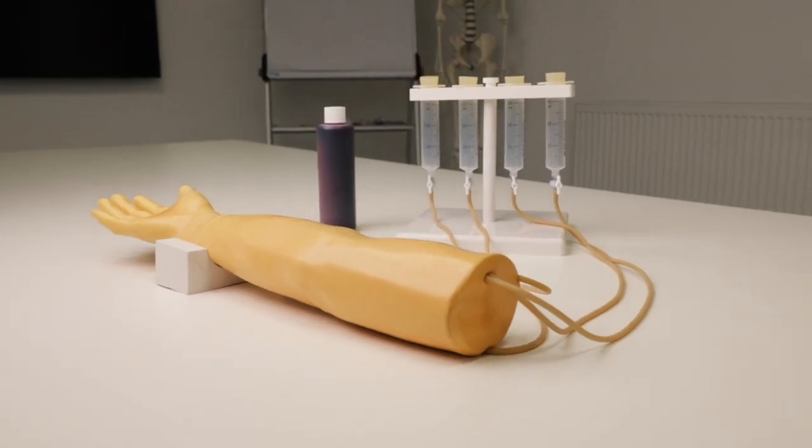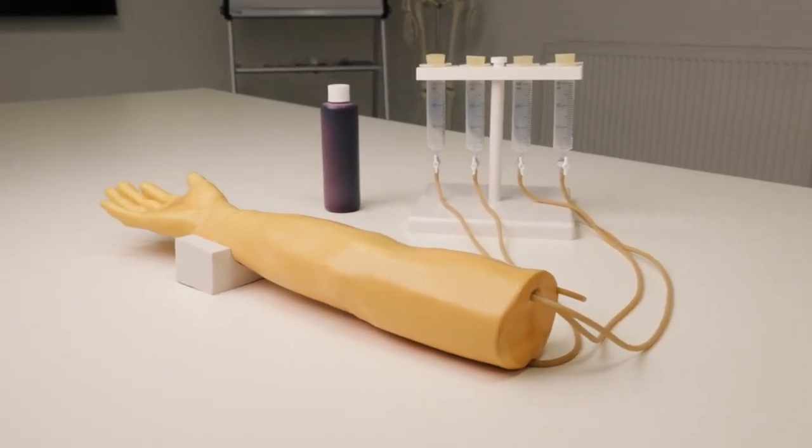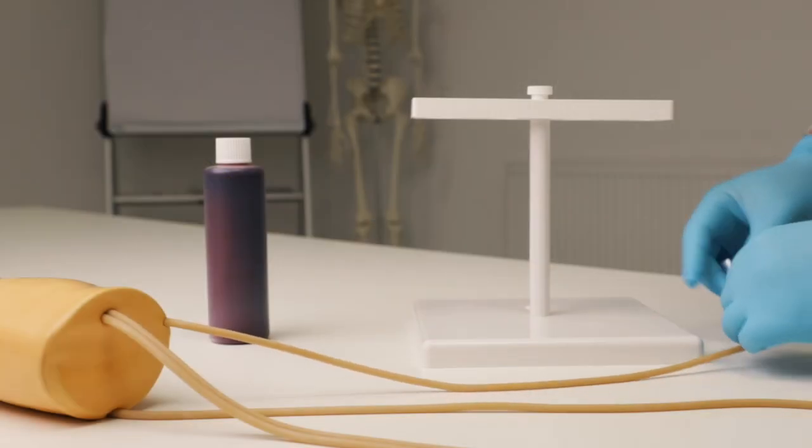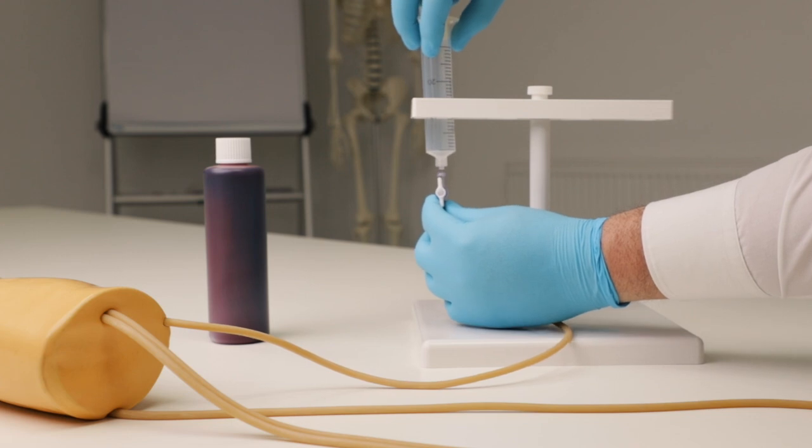In this video, we are going to show you how to use the Erler and Zimmer injection arm. Insert the measuring tubes into the holder and connect the vein tubes.